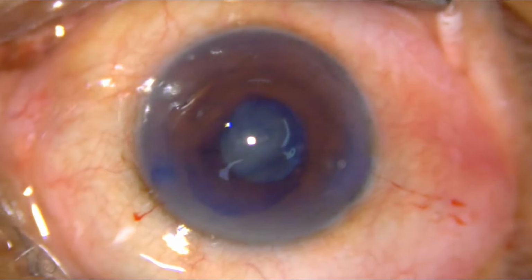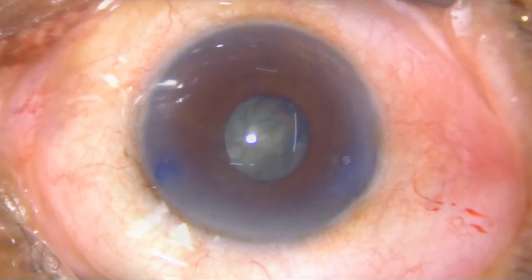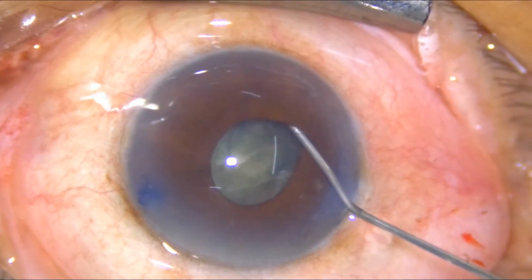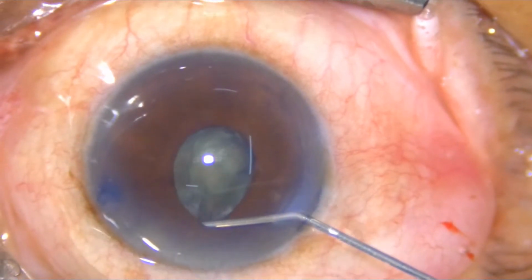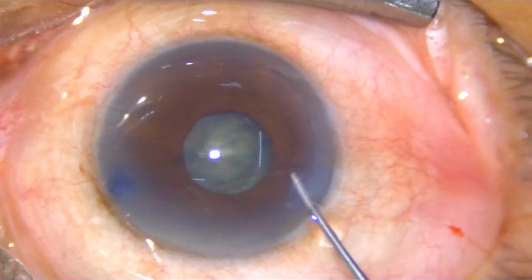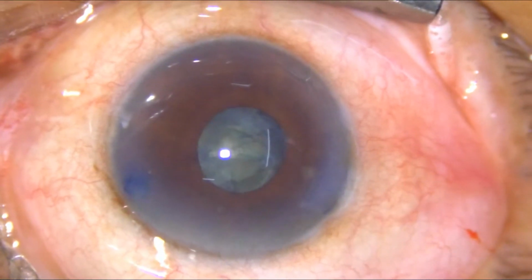Give prime importance to the first few steps of the surgery, and do not touch the probe unless and until you are satisfied and have a good rotation of your nucleus. Do hydro dissection multiple times below the iris. You can use the left hand to lift the iris on one side and do the hydro dissection by looking at the margin of the CCC.